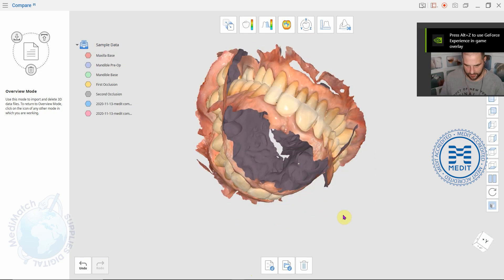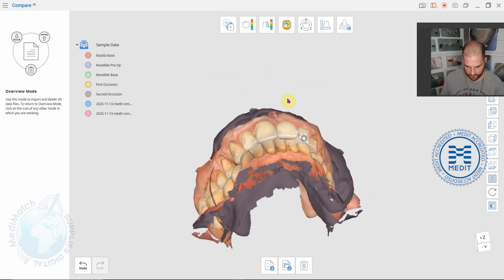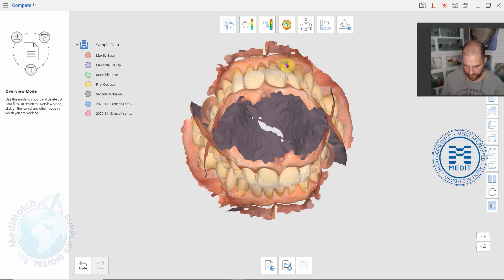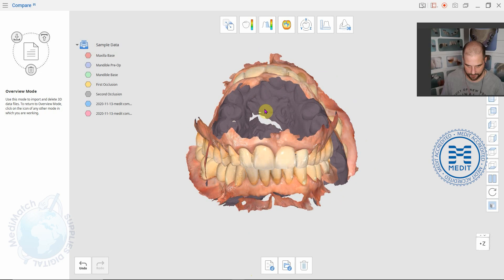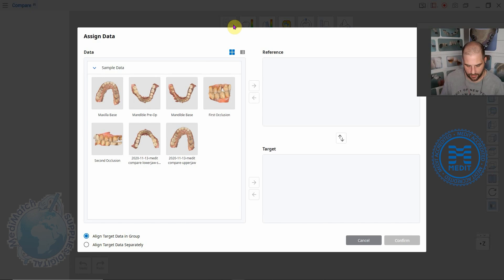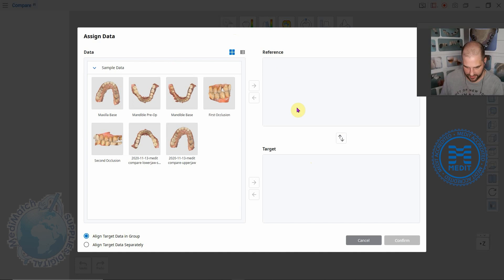It brings it in like this in a bit of a mess. What we're going to do is click on this icon up here at the top and we're going to set a reference scan and a target scan. It's basically the two scans that you want to compare against each other, one being the reference and one showing the difference from that reference point.